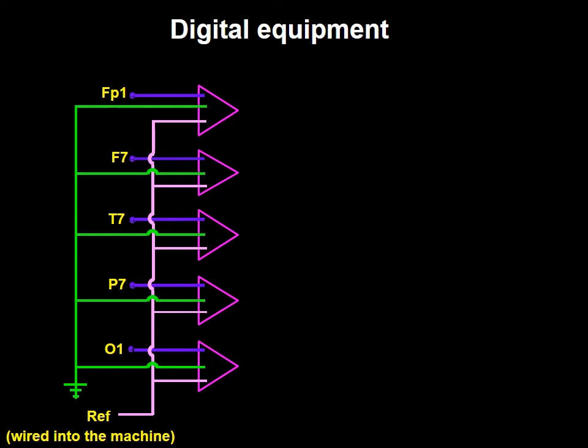In the digital world, this diagram is used in all instances to reconstruct bipolar montage, common referential montage, or any other montage. And this is all achieved by the introduction of a common reference to all differential amplifiers entering through G2.